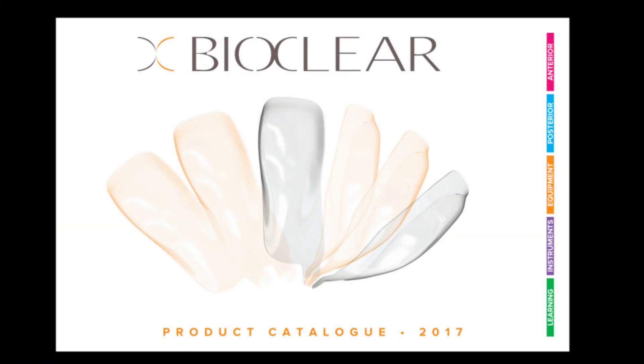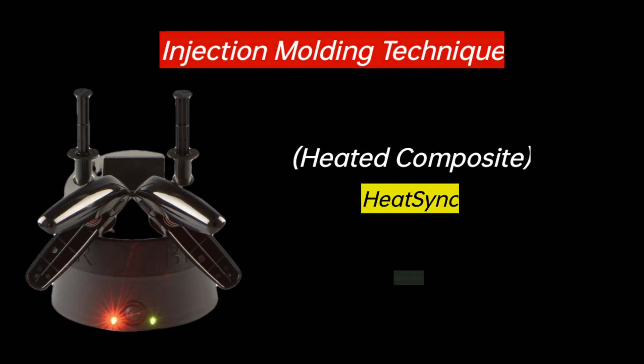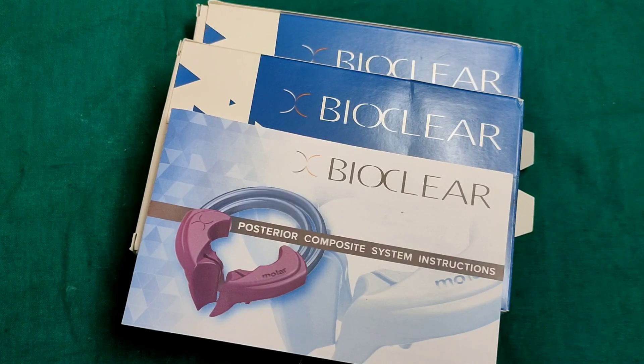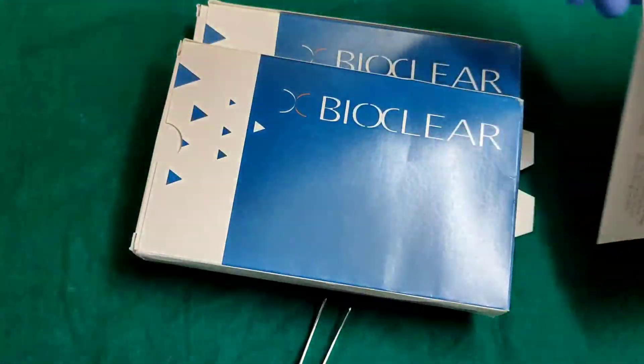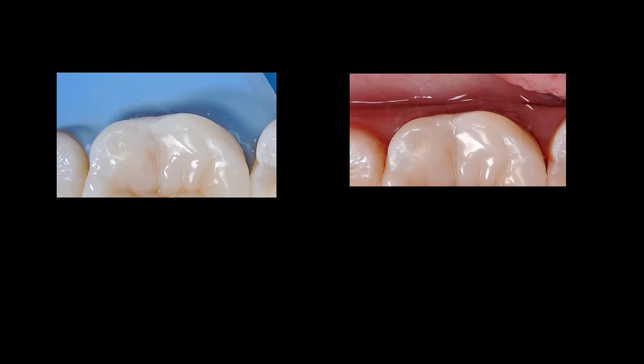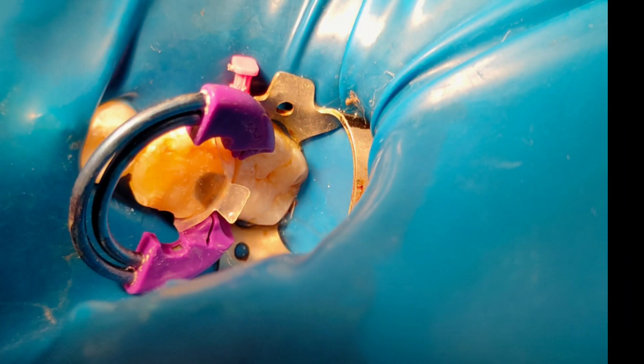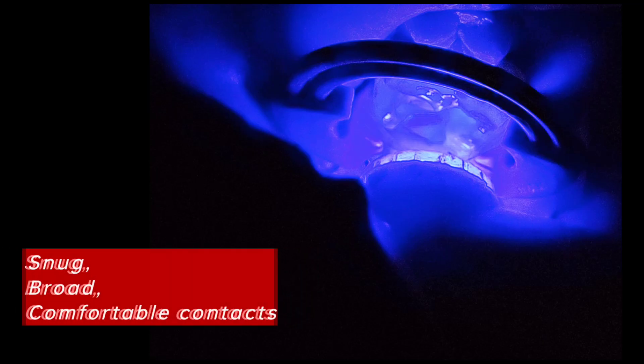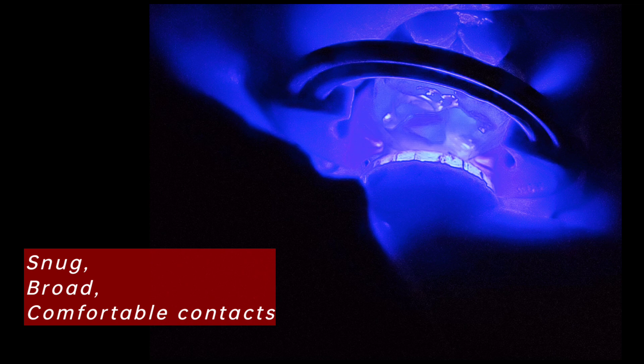This system was developed specially for use with the injection molding technique using heated composite. BioClear Posterior System offers a comprehensive array of matrices, wedges, and rings that allow for treatment of most posterior clinical situations. The manufacturer claims that BioClear's posterior products help to create snug, broad comfortable contacts every time.